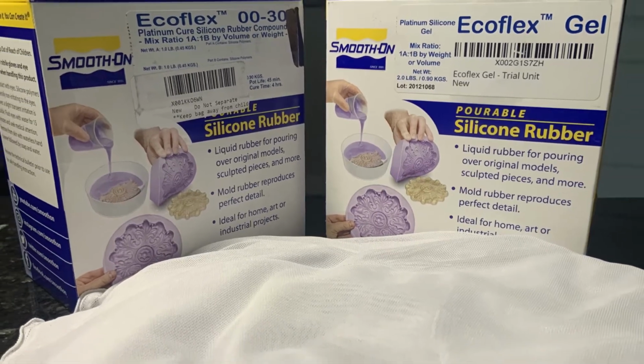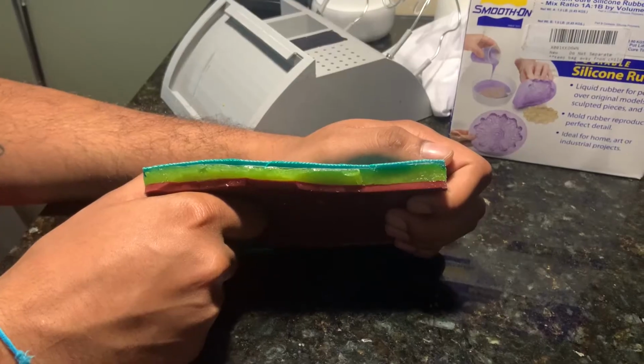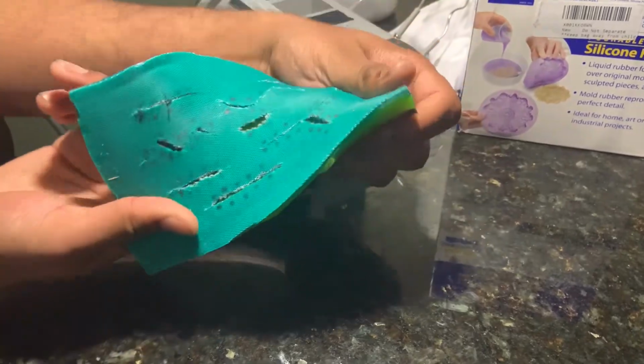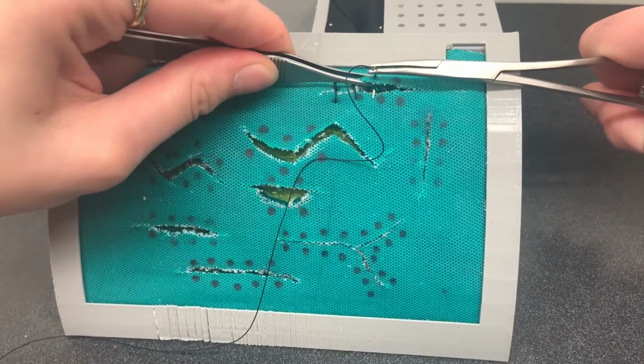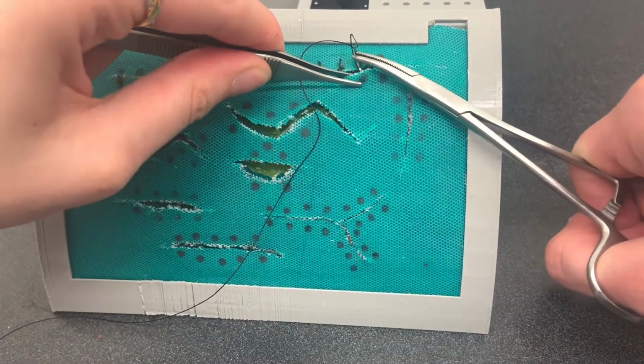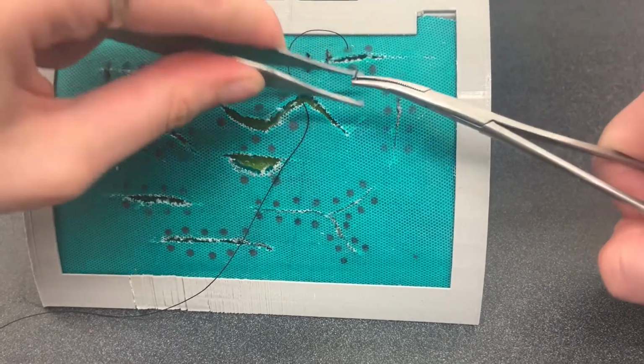The synthetic skin was designed using a combination of silicone gel and nylon mesh. It both simulates the properties of skin and is resilient enough to endure multiple uses. Nonlinear cuts simulate suturing. For this exercise, a piece of synthetic skin with pre-cut nonlinear lacerations is provided, set into the side of the device.